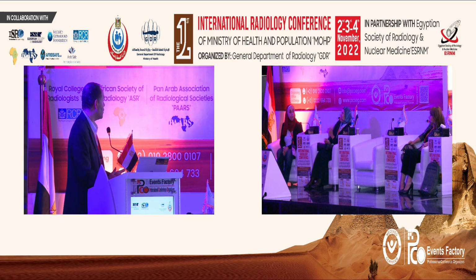My last question. Oh, sure. What about ultrasound of the small bowel? Ultrasound, I think it's still a work in progress. And I think there are a lot of advances, especially for you guys. I don't know if we use contrast enhanced ultrasound here or not. Do we? No. Not yet? It's against the law. I think it's mostly research work for elastography, ultrasound elastography for assessment of bowel fibrosis and that stuff. Second thing, for contrast enhanced ultrasound, it's still research studies going on.